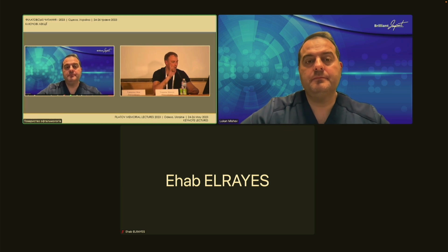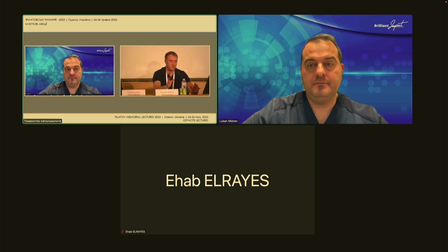So I have one question. I started using Ingenuity about a month ago, and I have some problems. First, I saw that you use a chandelier illuminating system for your surgery. I typically use 3-port vitrectomy, and I get aberration when my light falls on the metal of the vitreal probe or forceps or something else. I see light reflections around, which is not very good. Can you say something about your experience?